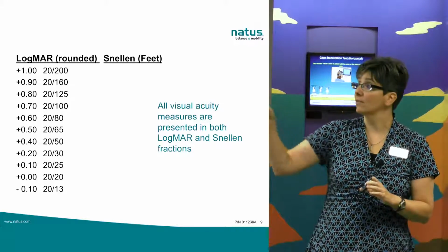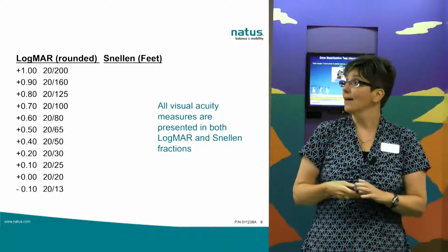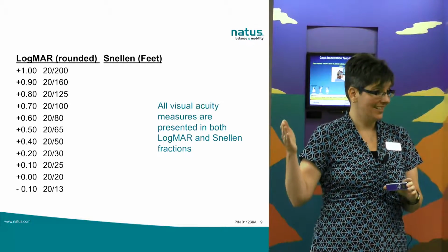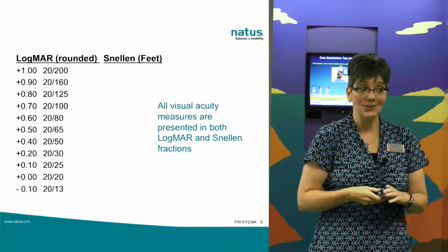So it's a pretty big E that will show up there. Yeah, and that would be equivalent to 20/200. So if your patient can see at 20/200, they'd at least be able to start the test. They might not be able to get too far into it, though.